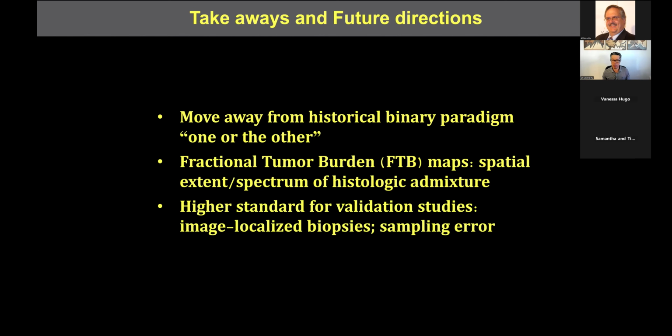I think an important note is that we need to start holding validation studies, whether it be for DSC perfusion or validation of other imaging techniques, given the very common intratumoral and spatial heterogeneity within tumors like GBM.